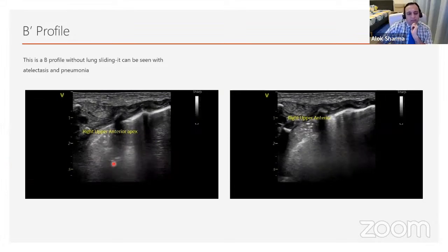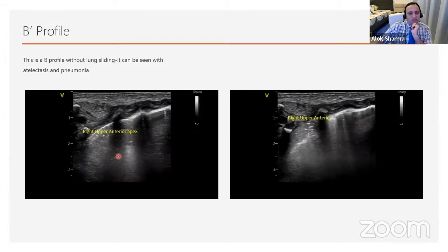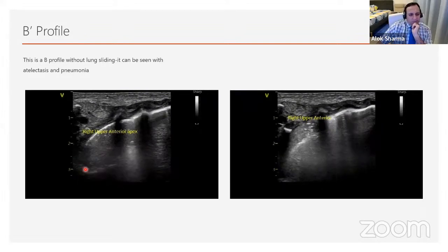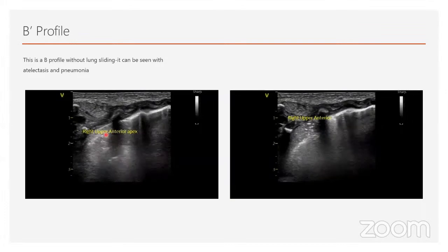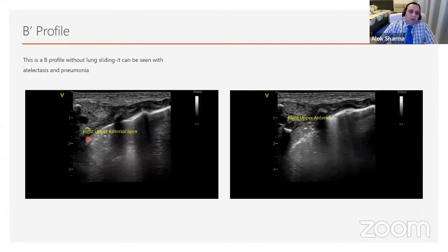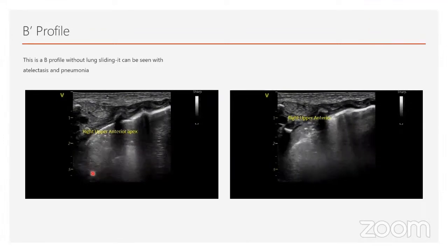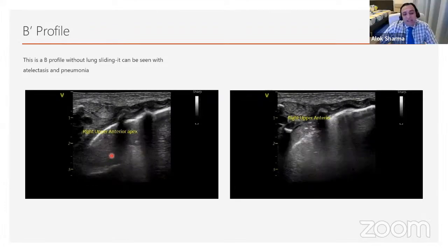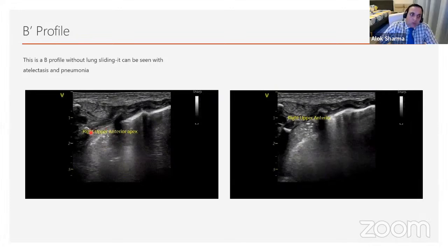Do you have any B lines kind of, or is this kind of a... Do you have any A lines? No. Okay. So what you've got is you've got a pleural margin that's fairly well defined. You've got these kind of static air bronchograms, the dots that you see, with an area of consolidation. Okay. So, I mean, theoretically, this is a consolidation for you.